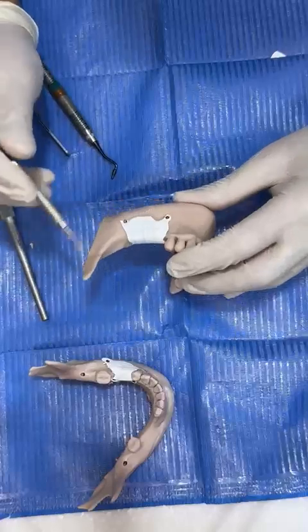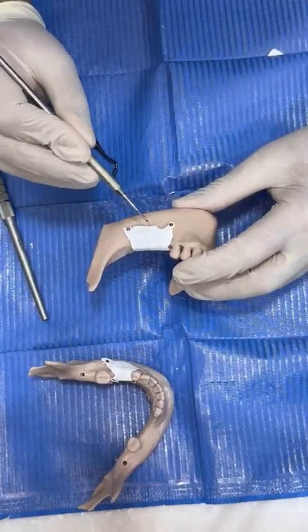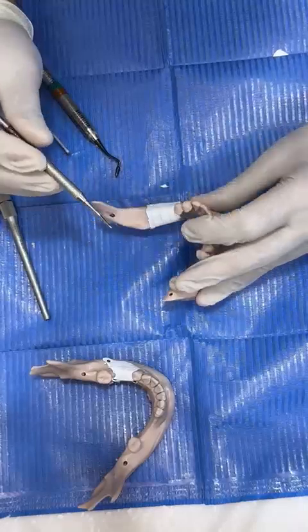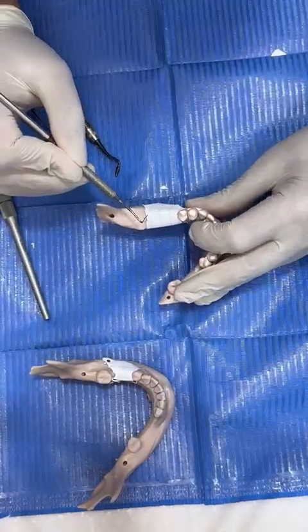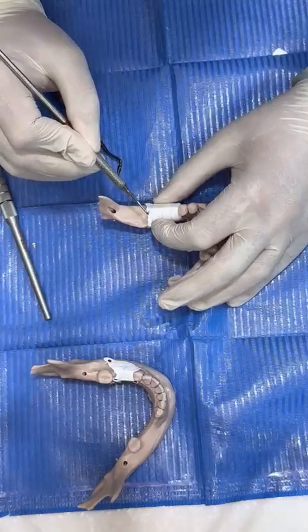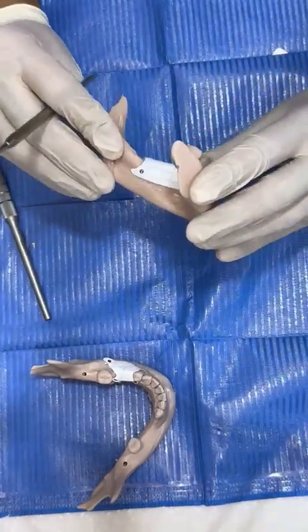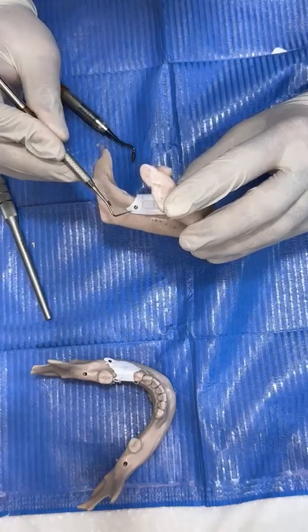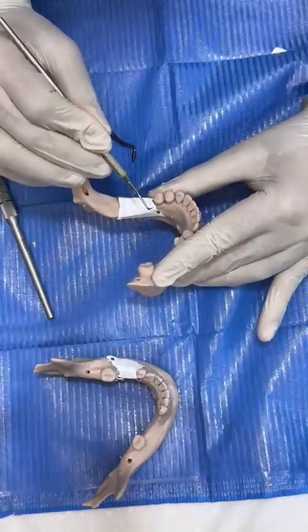Then you can finish your case with 2 or 3 tacks here on the buccal. You don't need Profix here. This is very accessible, and you should put one on the crest here, on the distal one. Then I can cut all this excess with the blade as I showed you here.